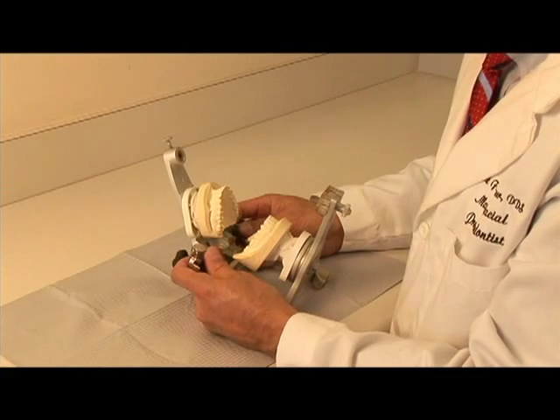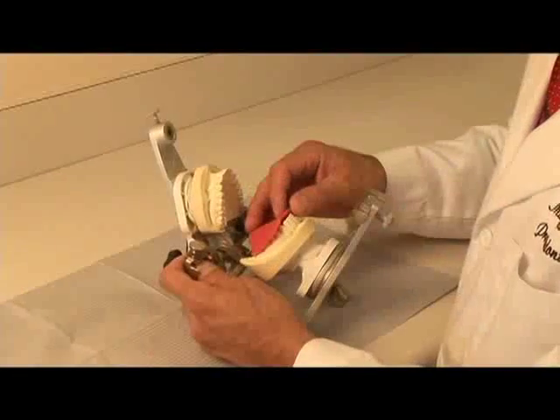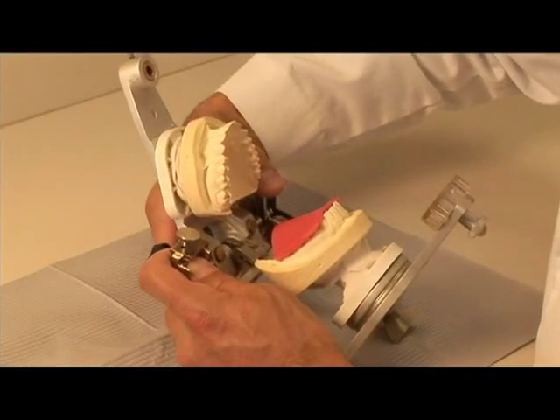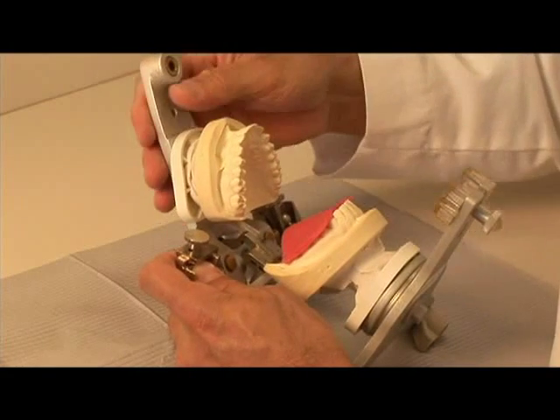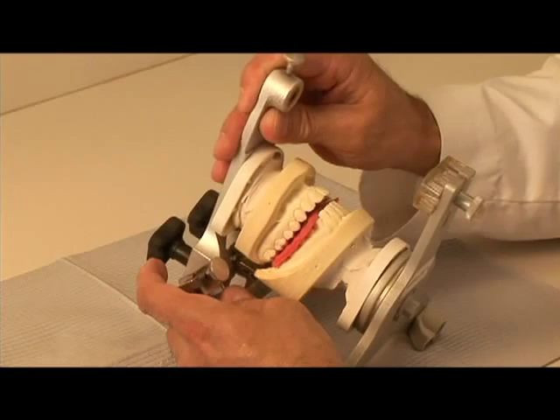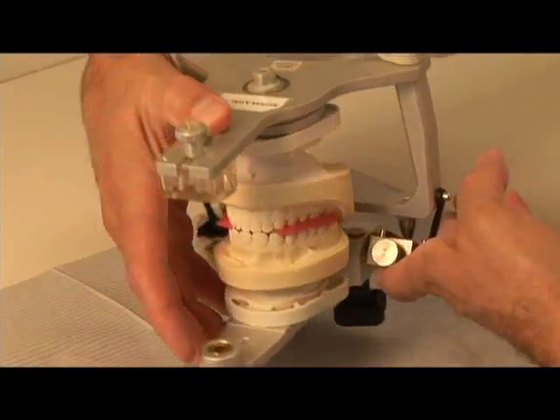To set the protrusive guidance, remove the incisal guide pin and carefully place the protrusive record on the cast. Unlock the centric latch and carefully rotate the maxillary cast into the protrusive record. Carefully invert the articulator.